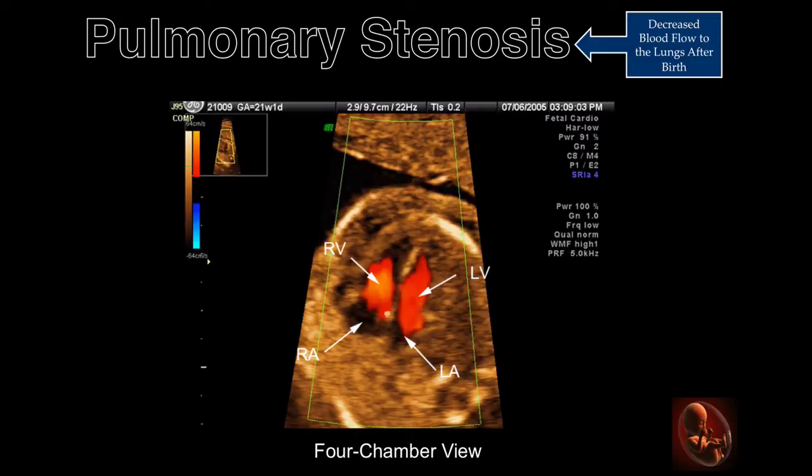This Doppler image is taken from a transverse sweep through the chest. In this image, the four-chamber view appears to be normal, with no evidence of disproportion between the right and left atrial and ventricular chambers.